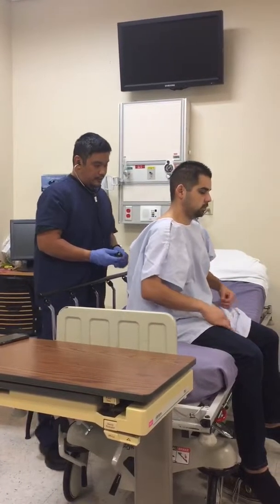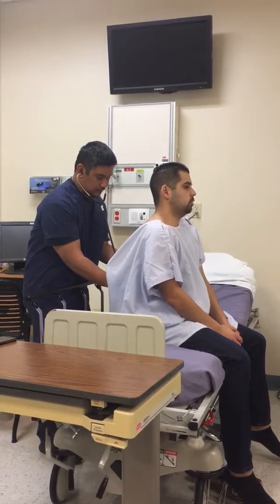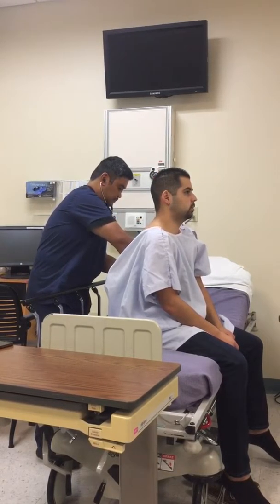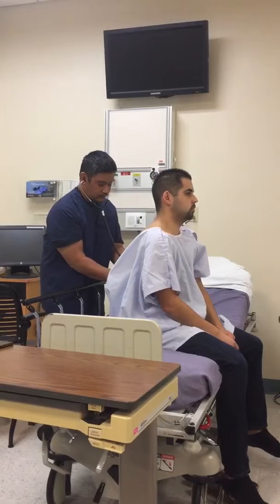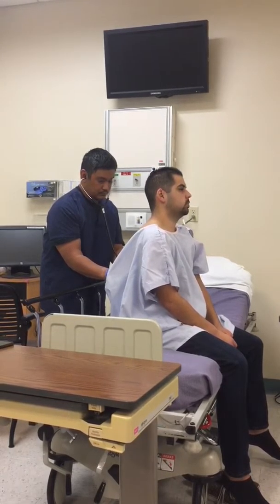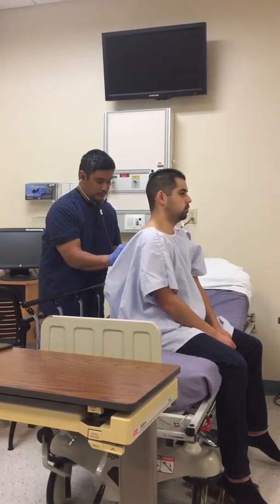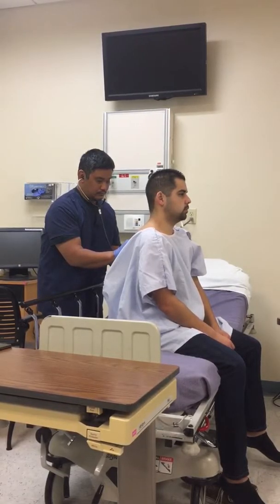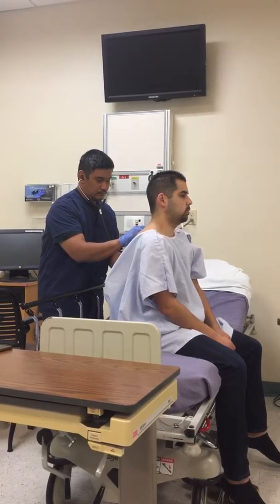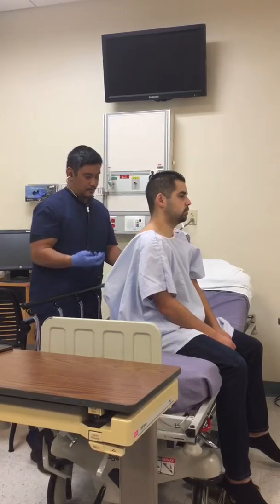Wherever you feel it, just go ahead and take a deep breath in, okay? All right, thank you, Christian.